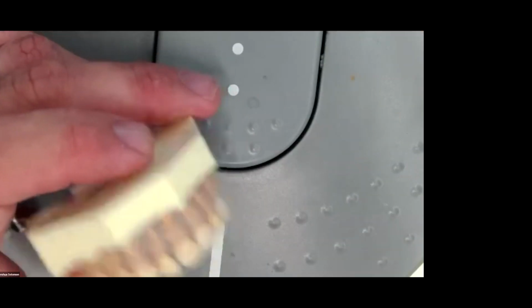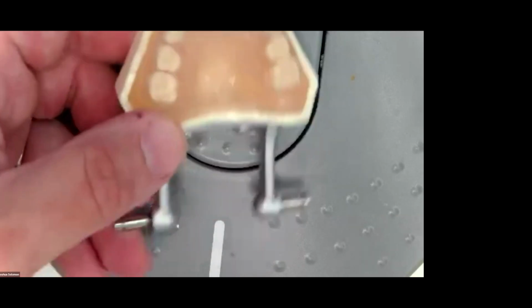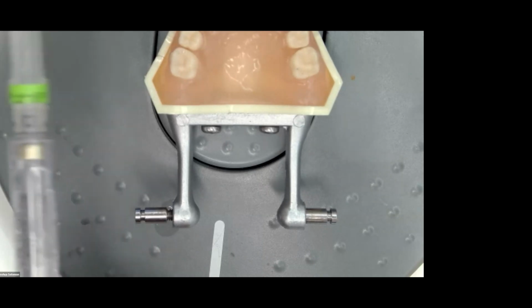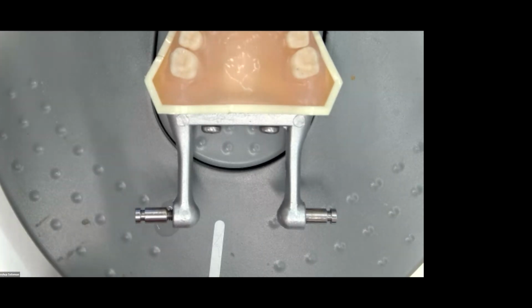Awesome. Next question was, are you changing out the needle for each new quadrant? I am. You know, if it's a very young patient and the kiddo's having a tough time, have I used the same needle for 2 different quadrants before? Yes. But, you know, what's the cost of the needles, Chris, about, or Jordan? 27 cents. 27 cents.